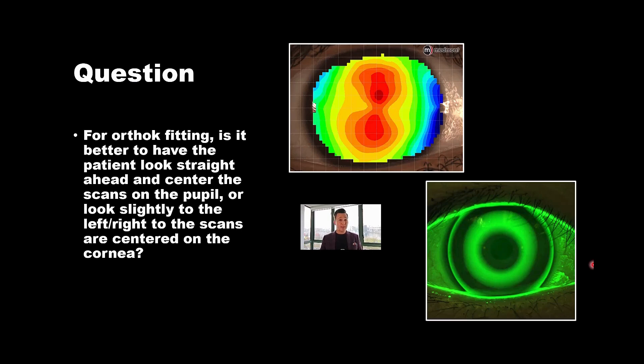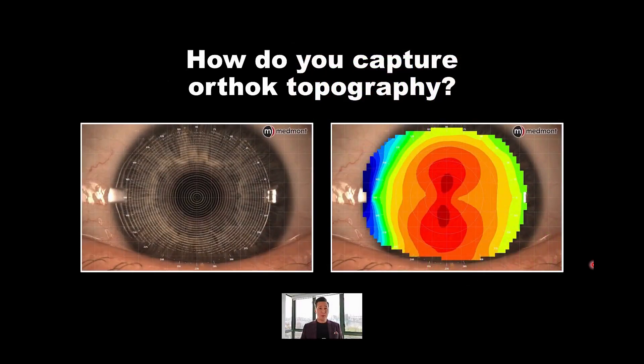A great question for ortho-k fitting: is it better to have the patient look straight ahead and center the scans on the pupil, or look slightly to the left or right so the scans are centered on the cornea? When you capture topography along the line of sight — the visual axis — with the patient looking right down the center of the unit, it decenters the placido reflection to the nasal side, giving a topography that appears with a little more blue on one side and less on the other.